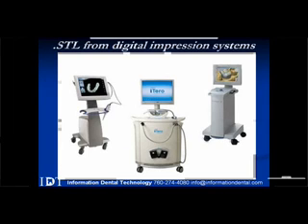Another form of STL. Can I stop you? Sure. First of all, how can you recognize the correct threshold for a correct fit? That's a great question. A lot of it is just experience in utilizing the technology, and it depends on the software program that you're using, how that's set up and designed. It's really just utilizing it with experience over time.